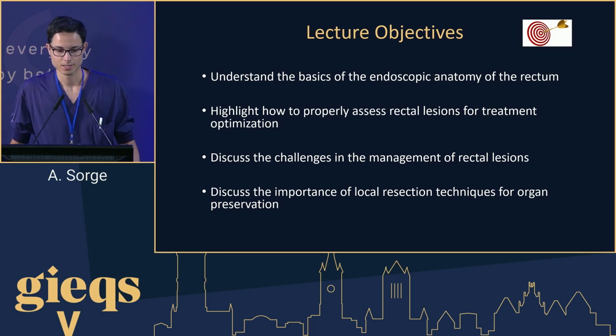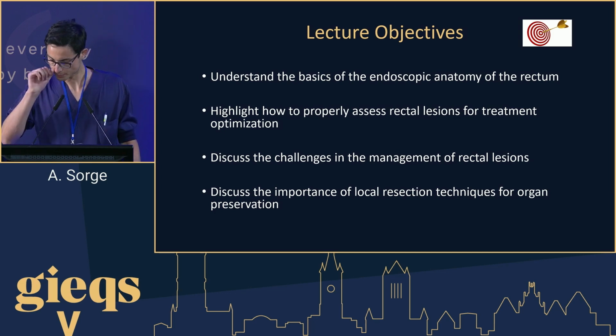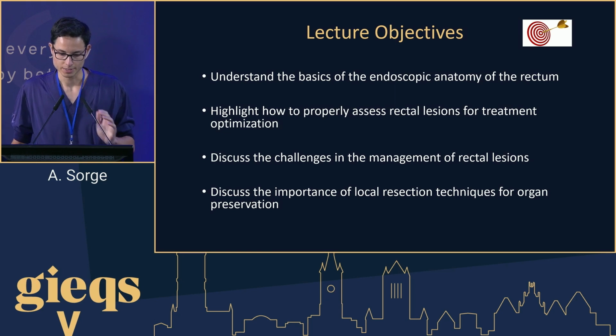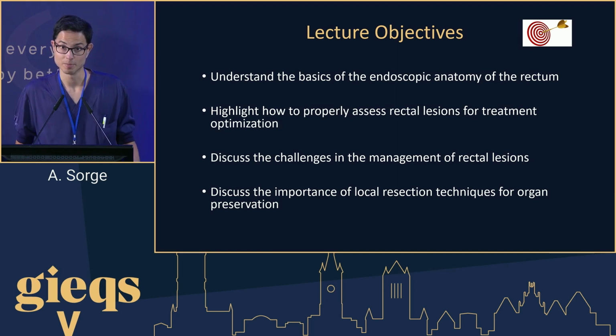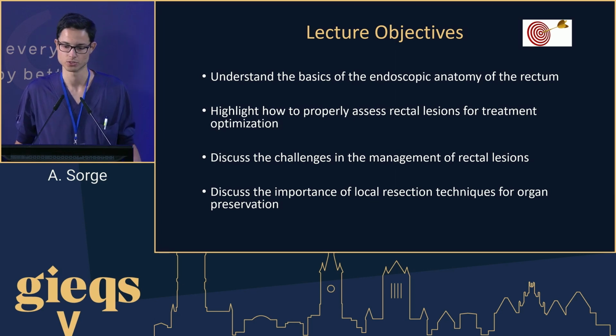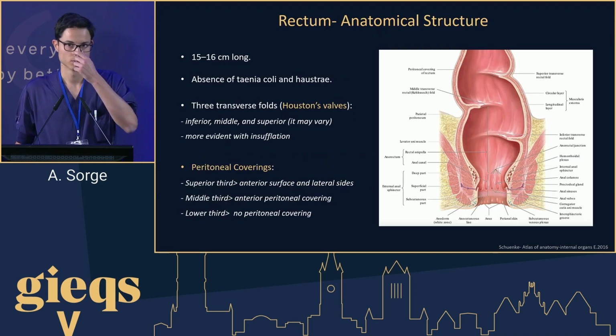So we know that rectal lesions are often challenging, and understanding the basics is really key to then optimize the treatment. We will discuss the challenges in the management of rectal lesions and the importance that local resection techniques have for organ preservation. So, starting with the basics.